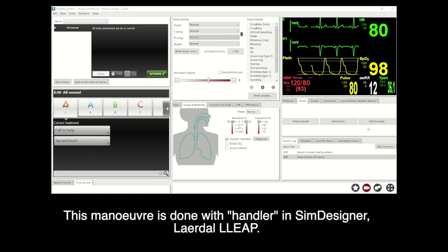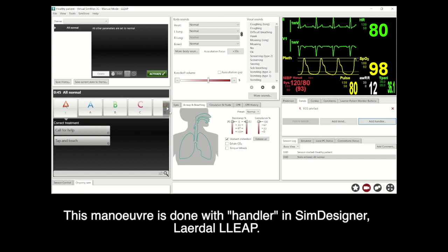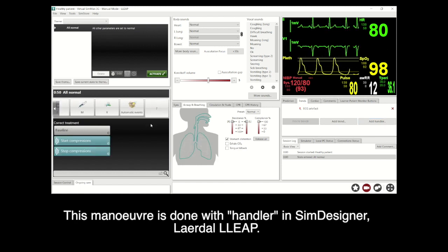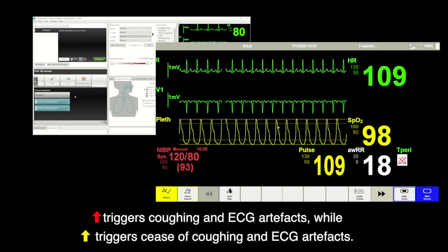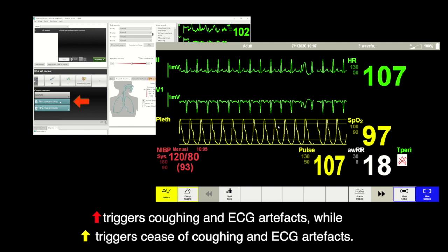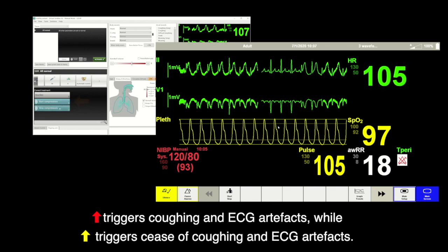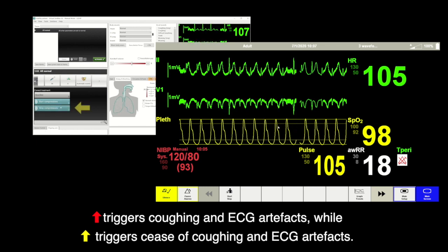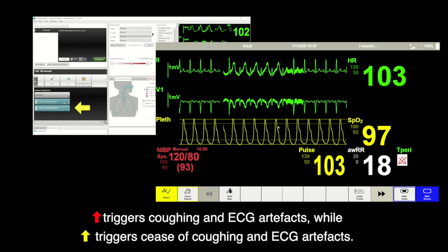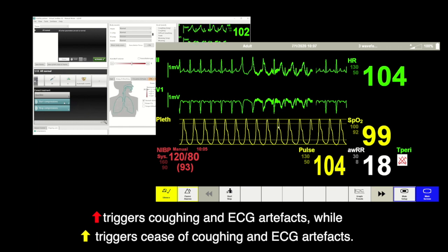This is an example done by a handler and SimDesigner using Laerdal LLEAP software. The red arrow points to the icon that triggers coughing and the ECG artifact. The yellow arrow points to the icon that triggers the cessation of coughing and the ECG artifact.